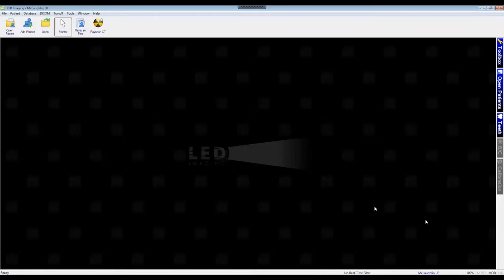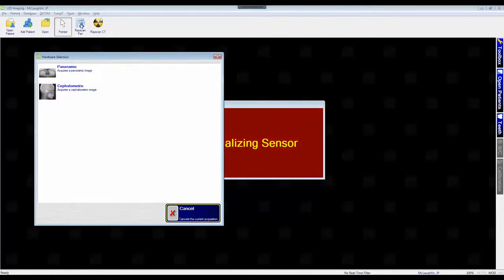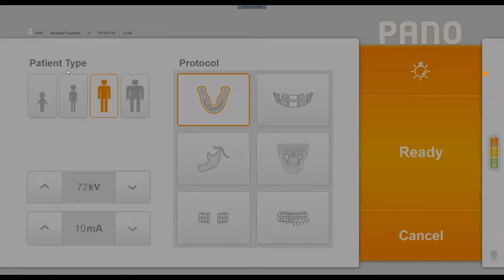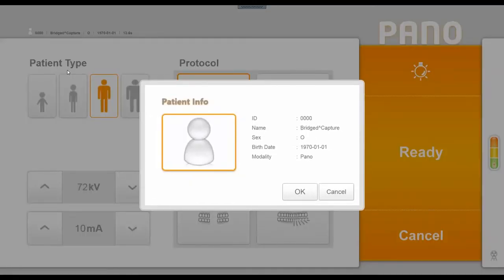We first want to get the computer side ready. So from LED Imaging, I'm going to click on the RayScan Panoramic icon, which initially gives us a window to choose between panoramic and cephalometric imaging. I'm going to choose panoramic, and then this will launch the RayScan acquisition icon.